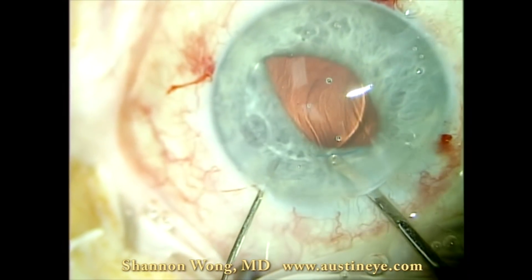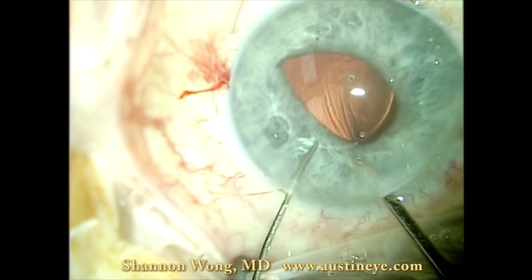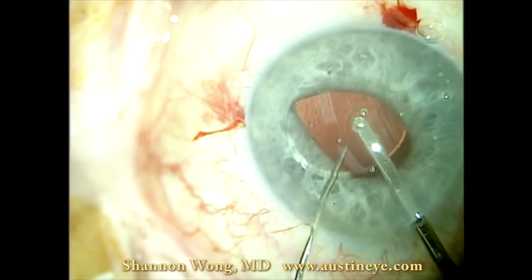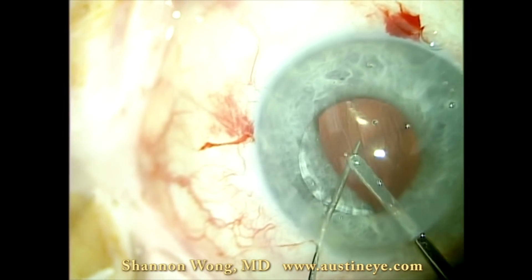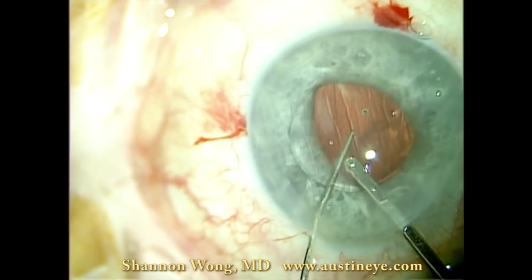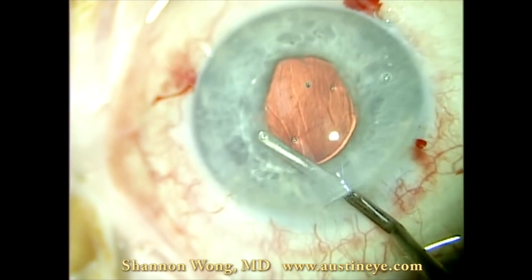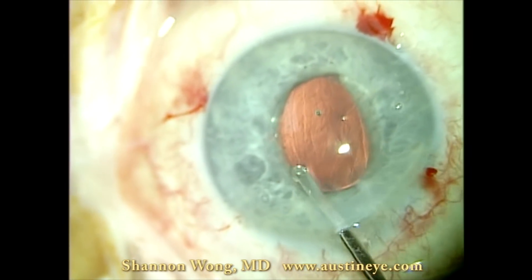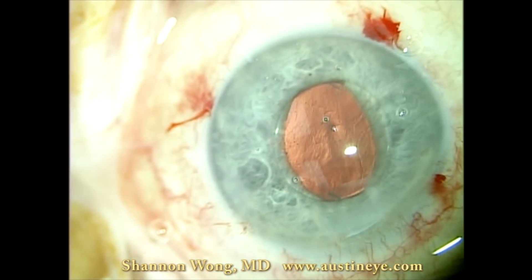Here we have prolapsed the optic anterior to the iris plane. The pupil is semi-dilated, and we make sure the optic is anterior to the iris plane and that the haptics are in the sulcus. Once the lens has been positioned in this configuration, we infuse a miotic agent to constrict the pupil so the optic remains anterior to the iris while we suture the haptics in place.